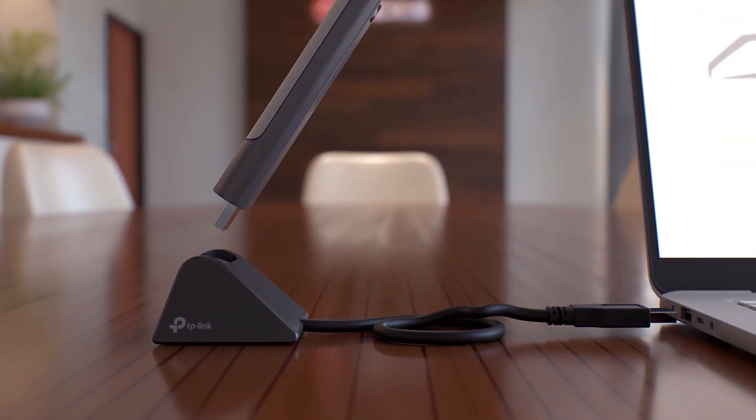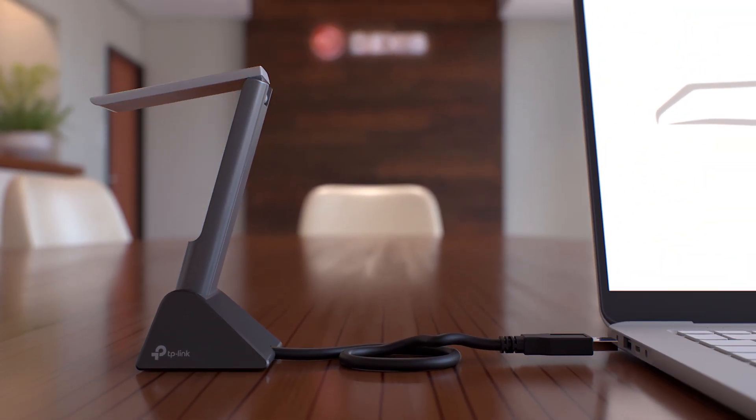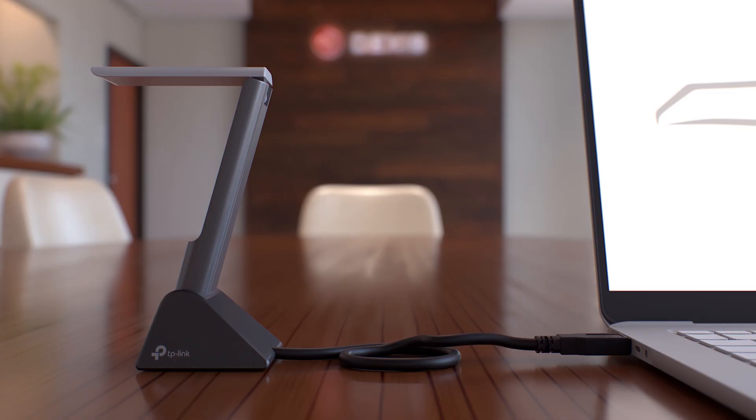The Wi-Fi adapter ensures fast, stable connections when plugged into your workstation's USB 3.0 port. The included dock allows for flexible positioning, especially when workspace access is tight.